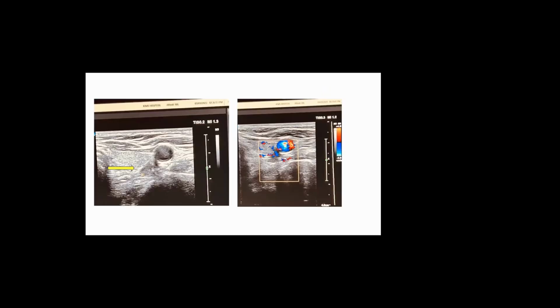So this was a very important case, where this was a case of MEN1 actually. The radiologist had missed this small parathyroid. This patient had undergone surgeries earlier in Bangalore, but she had come with recurrence. So now we could clearly see on MIBI scan only one abnormal parathyroid gland. But when I performed the scan, I identified this parathyroid, and I'll show you in the images later that this was also indeed an enlarged parathyroid gland, and this patient is now cured of PHPT.